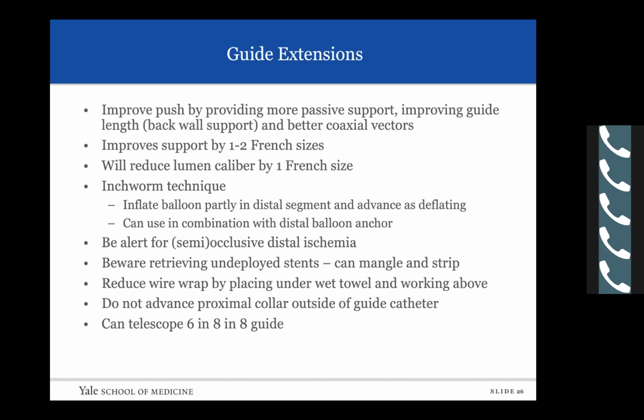The one caveat is if you do not deploy your stent and you decide to pull it back in, sometimes pulling it through the guide extension will unroof the proximal portion of the stent from the delivery balloon and then mangle and strip it. So it's preferred to really remove your guide extension and then pull the stent back into the guide itself and then remove it.